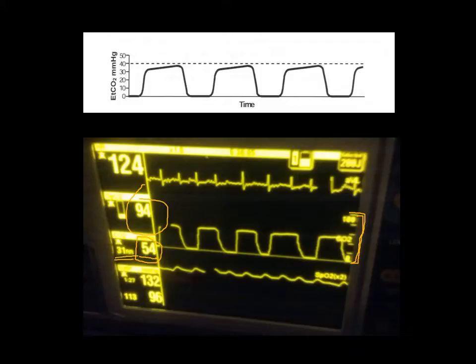But remember, ventilation is not just rate, it's also depth. So he's breathing fast, but he's breathing very shallow. And this patient actually had several rib fractures, and he was in pain, so he didn't want to breathe very deeply. As a result, his carbon dioxide went up, and his oxygen was low.